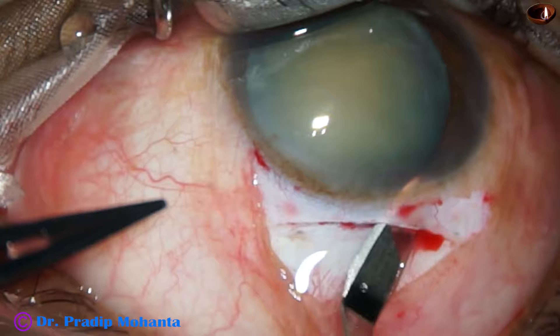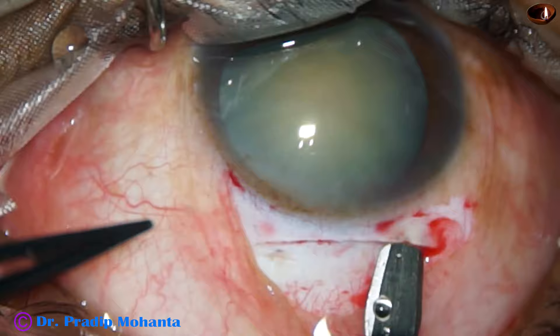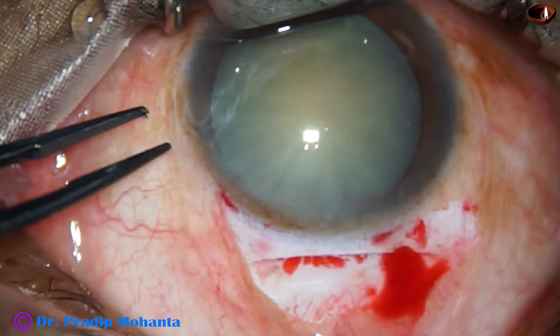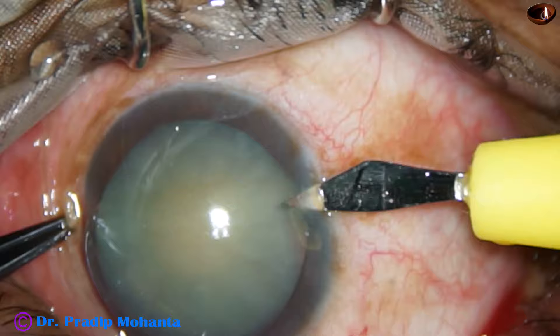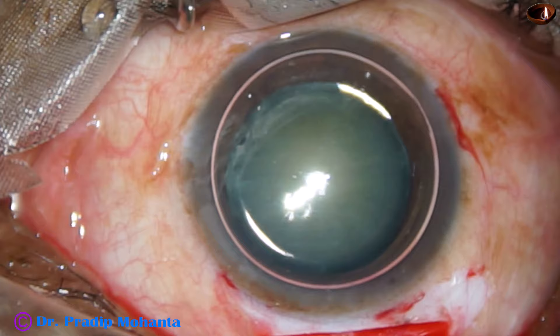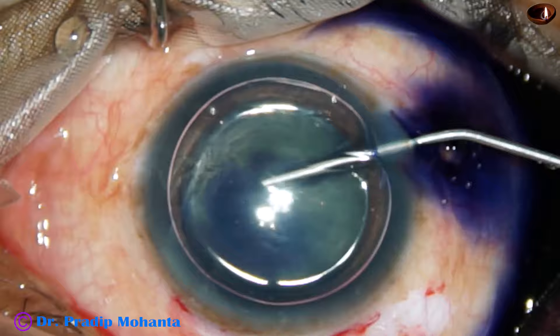The superior rectus bridle suture is holding the eyeball — I don't have to use the fixation forceps with my left hand. If we use the fixation forceps, sometimes we cause laceration of the conjunctiva and there can be subconjunctival hemorrhage, so that can be avoided if we place a superior rectus bridle suture. But we can also use the fixation forceps carefully and avoid the superior rectus bridle suture.